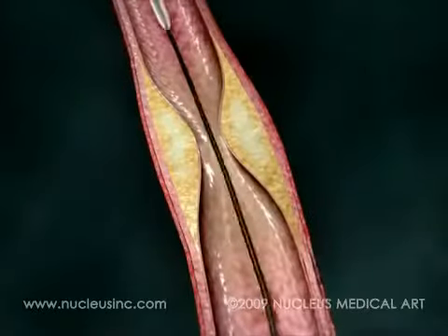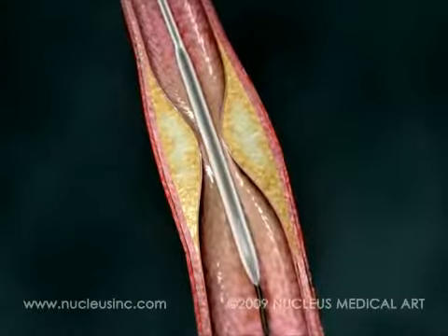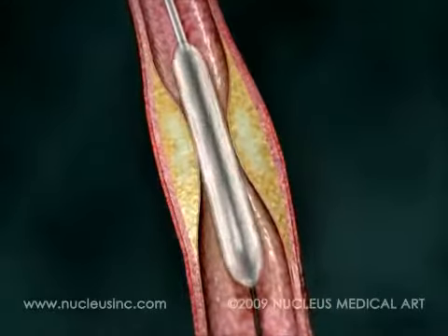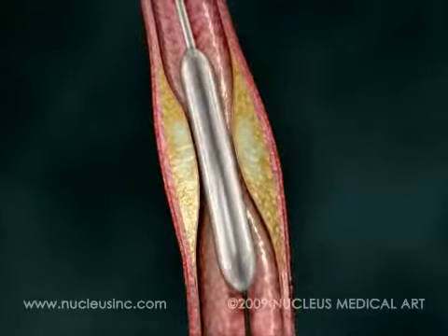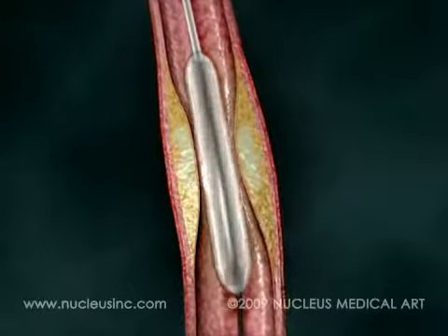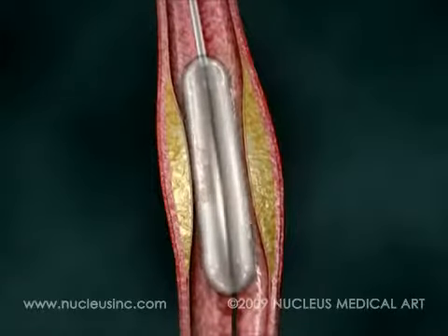Once the blockage is identified, your doctor will insert a flexible guide wire into the artery and advance a balloon-tipped catheter over this wire and into position at the site of the blockage. Rapid inflation and deflation of the small balloon pushes the vessel wall out, reestablishing blood flow through the artery. You may feel some chest pain while this is happening. The same procedure is repeated for each blockage being treated.